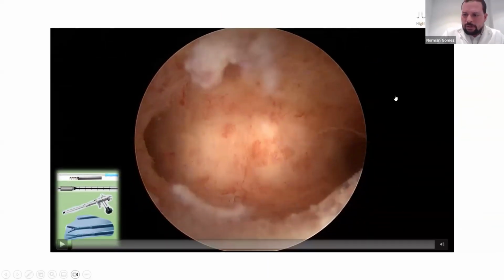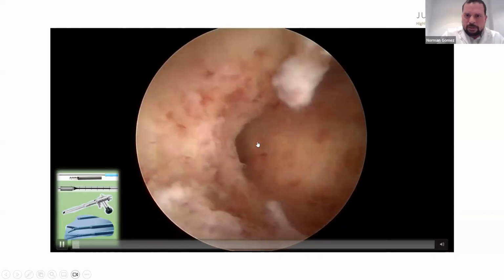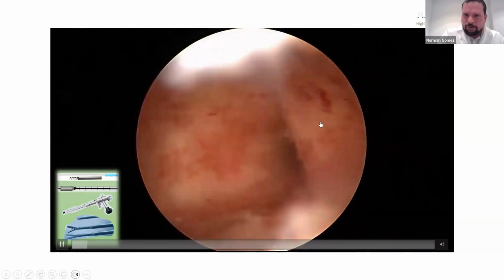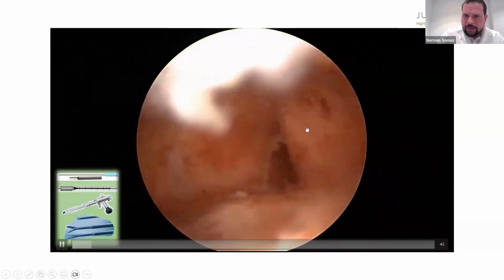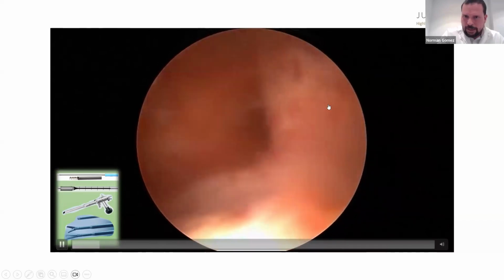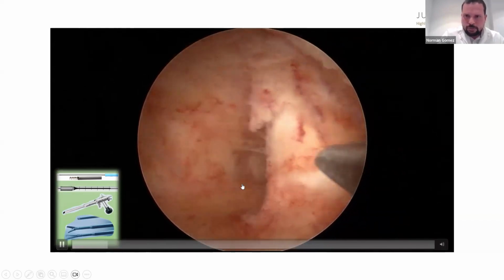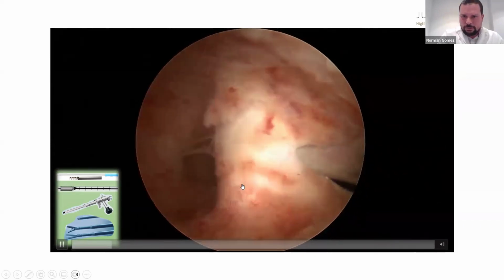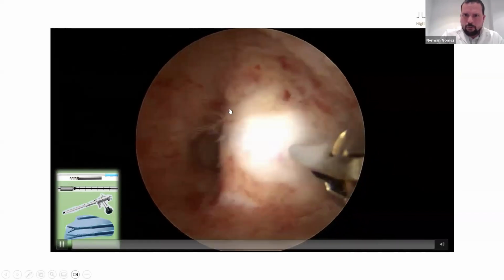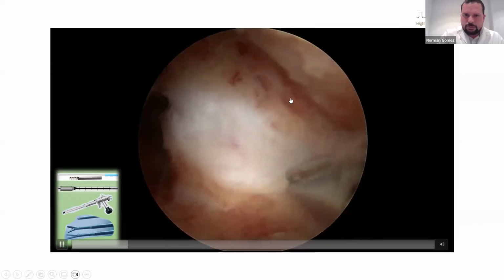This is another example of a combination of instruments. This patient has 3 fibroids in both laterals. We reduce the pressure. We can see and put in evidence all the fibroids here in this area. There are 2 fibroids here, lateral left, and also in the posterior wall of the uterus. We use the scissors, expose the fibroid, and always respect the endometrial tissue.